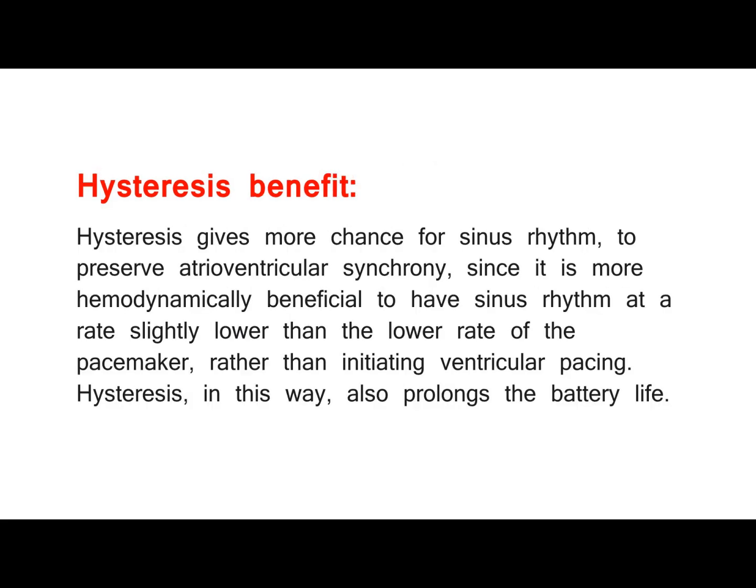Hysteresis benefit. Hysteresis gives more chance for sinus rhythm, to preserve atrioventricular synchrony, since it is more hemodynamically beneficial to have sinus rhythm at a rate slightly lower than the lower rate of the pacemaker, rather than initiating ventricular pacing. Hysteresis, in this way, also prolongs the battery life.